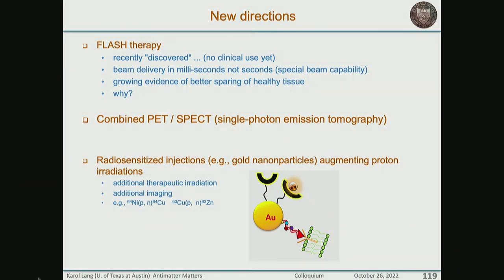It's mostly the cost issue, indeed, because remember, having smaller crystals turns out to be not a big problem, although the cost grows fast, but it's also photodetection. And there are ideas how you actually employ similar, less granularity photodetectors for more granularity crystals. There are ideas how to actually economize on the two.